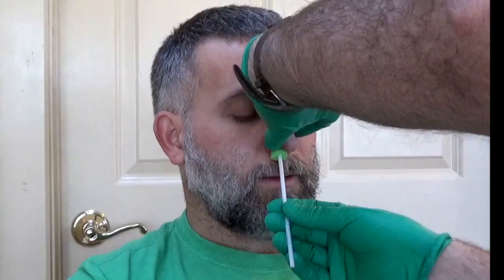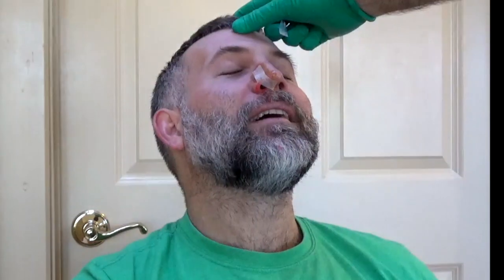Next, gently remove everything except for the hemostatic agent that's still in their nostril. Apply some benzoin along the side of the nose and the very bottom of the septum, and put a steri-strip on, which will hold the packing in place.